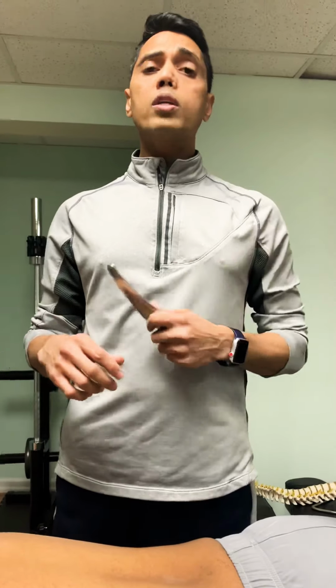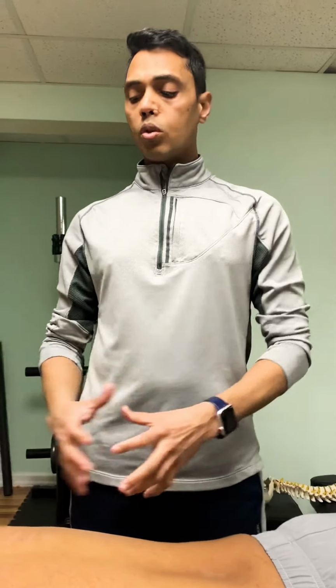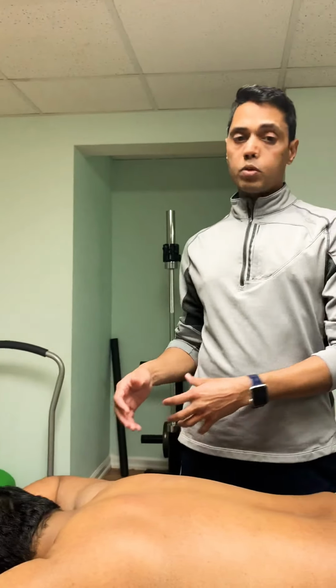If you want to know specifically about any clinical conditions, I would like to next time start with a series of problems. For a neck pain patient, what would you do? For a knee pain patient, what would you do with the tool? For a shoulder pain patient, what would you do with the tool?